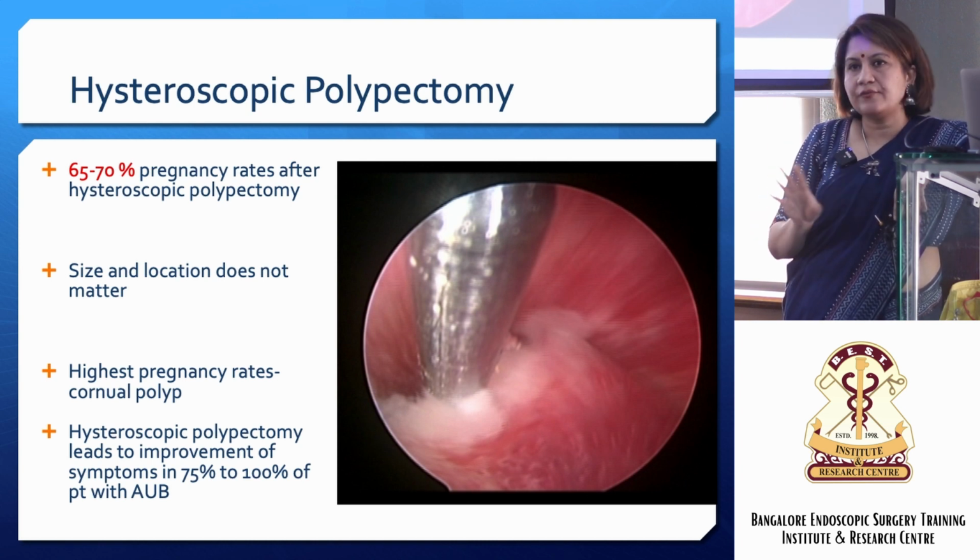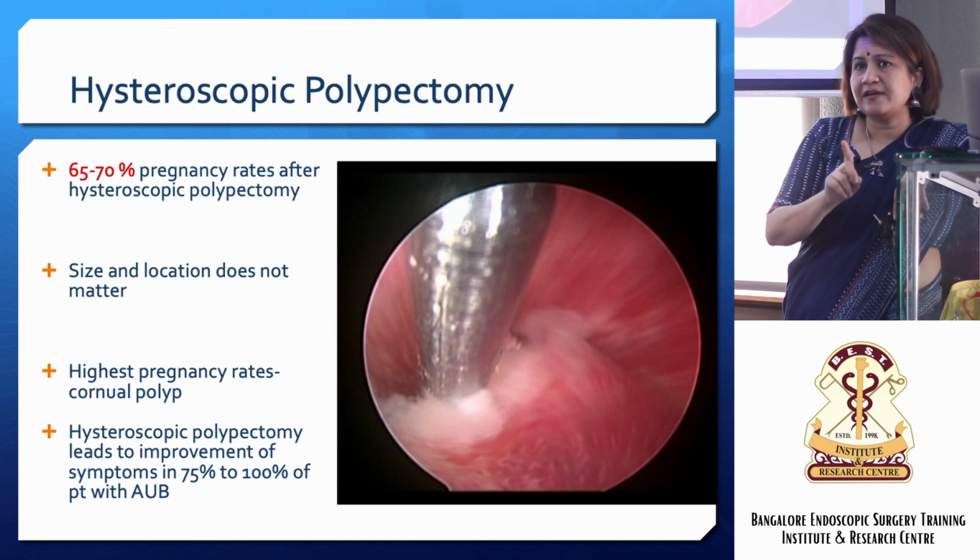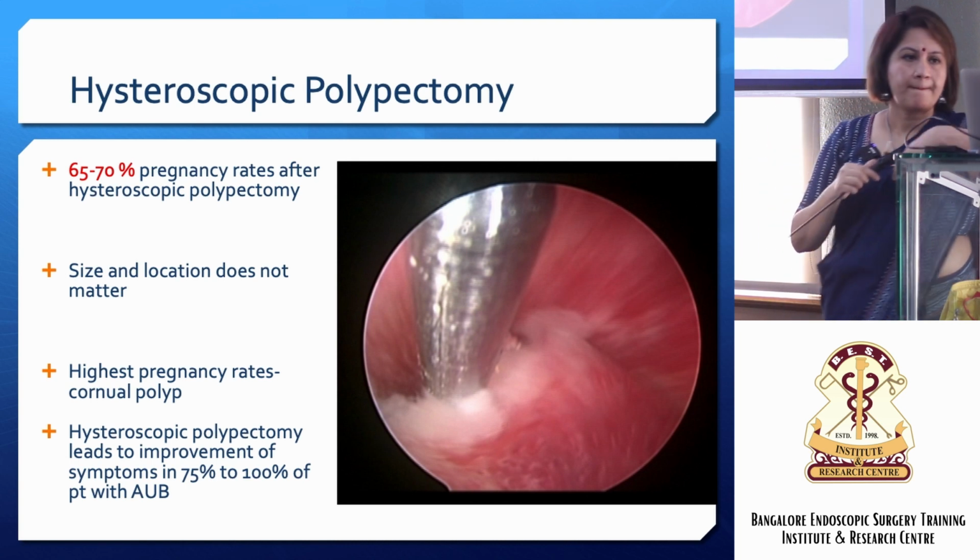You won't need to do anything for that. Polyps don't bleed much, because there's only one central vascularity and it will clot. By the time you remove your specimen, that would have stopped also.